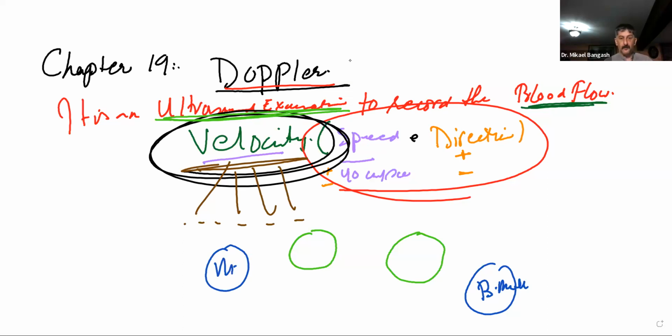And in between those were, respectively, color flow and one labeled PW, which are two separate Doppler modes.